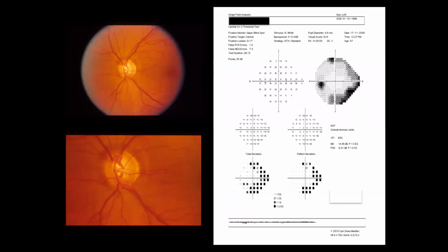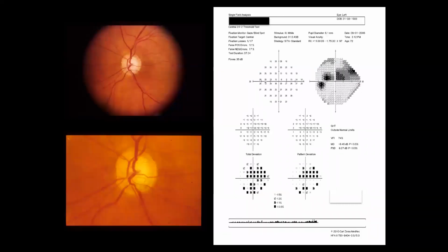So you are having a thinning significantly superiorly, and you have the densest scotoma inferiorly corresponding to the superior thinning. And you have as well here inferotemporal thinning. That's why you are having a corresponding superior scotoma as well. Thank you very much, Doctor.